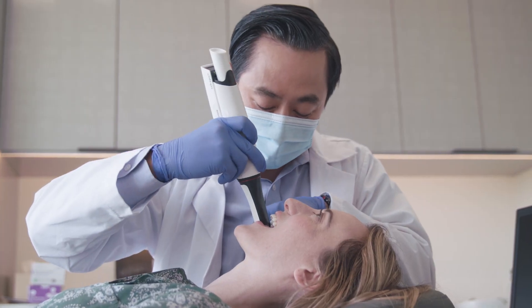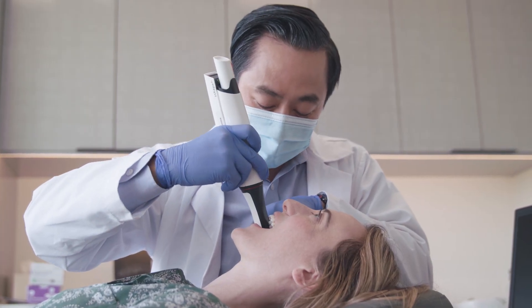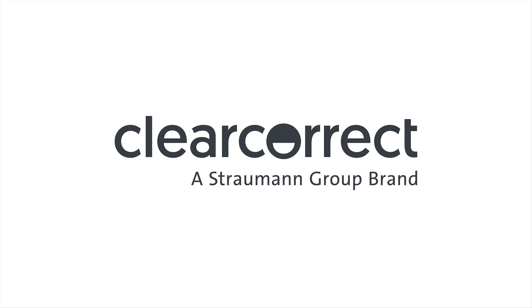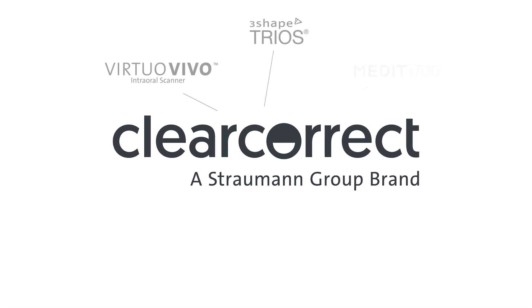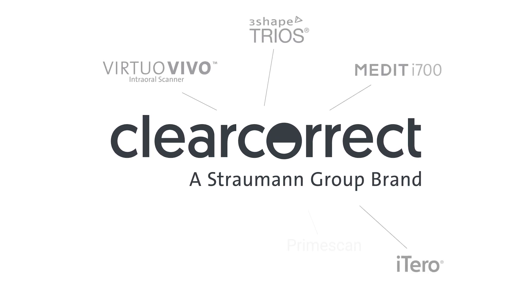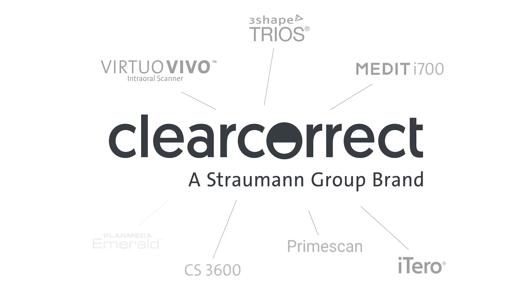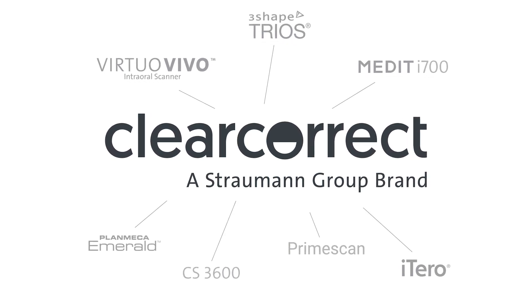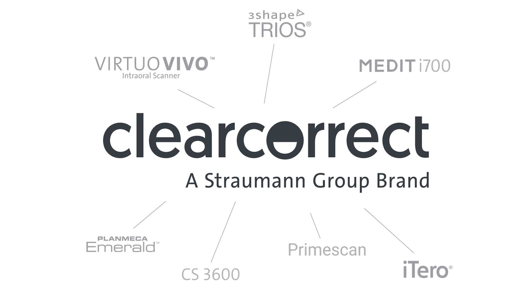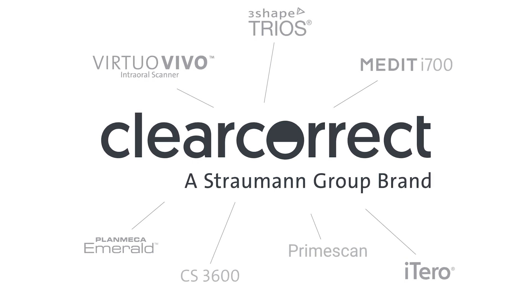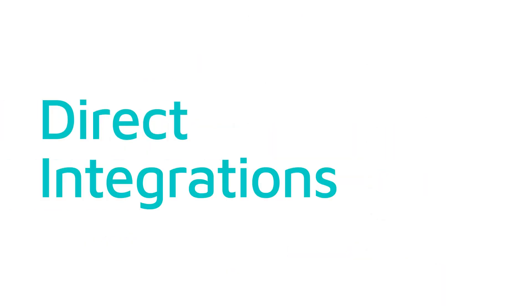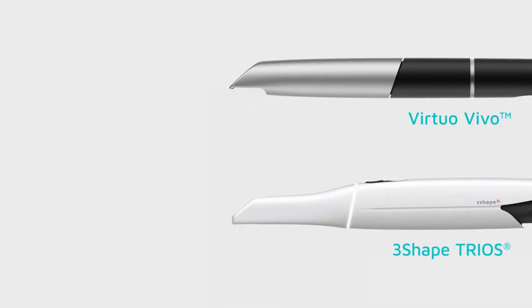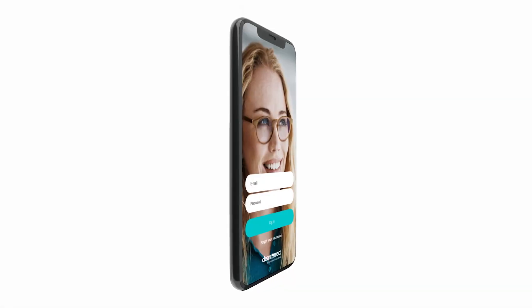Start cases faster using your preferred iOS system. Our open source platform gives you the flexibility to connect with virtually any digital scanning and imaging source, including direct integrations with leading scanners such as VirtuoVivo and 3Shape Trios.